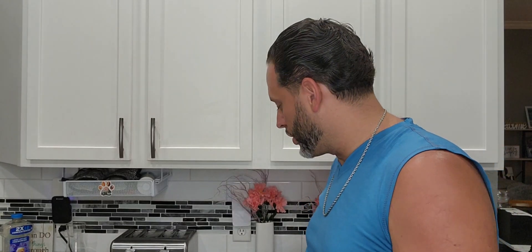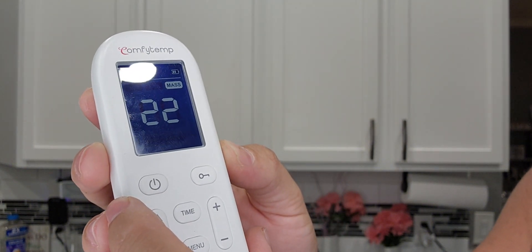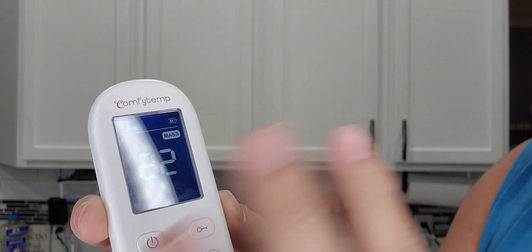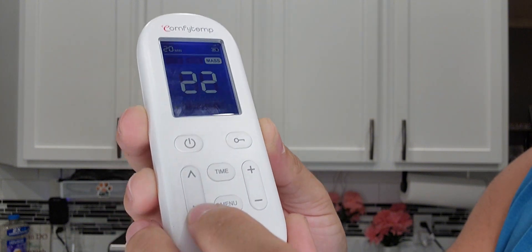It also comes with a charger right here. Since it is wireless, you will have to make sure you keep it charged up. You have your power button right here — we're going to turn that on. Once you set up the controls, there's actually a lock button right here, so if you hold that down it'll go ahead and lock the screen so you can't change anything.